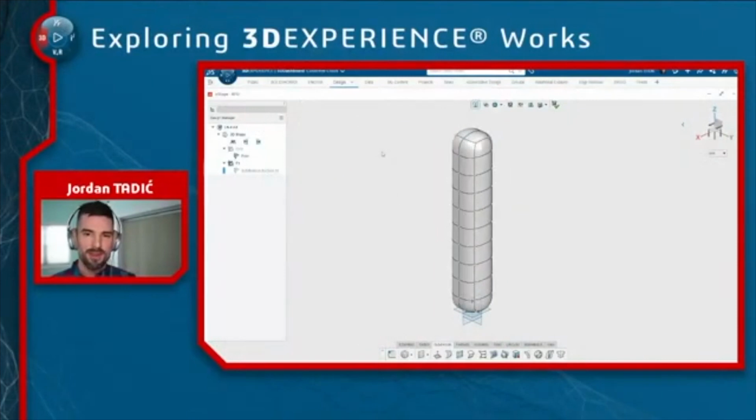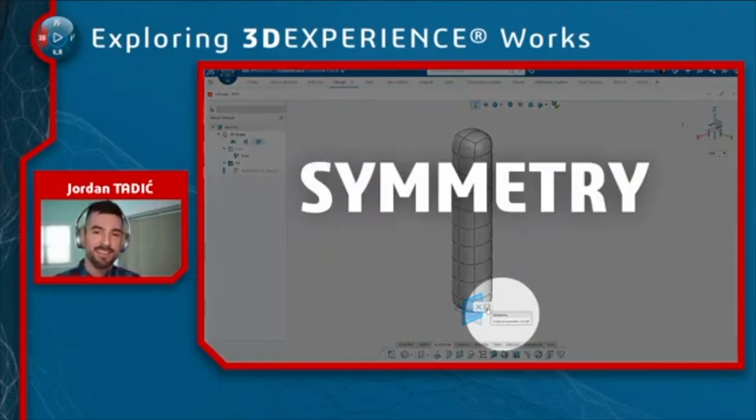Again, you don't have to put that much thought into it, because you could always insert loops or delete loops on the fly. And Gian, you showed last time adding symmetry to your design. Right. And already, in just the month that has passed between those sessions, we've added enhancements. Now I'm going to show you a couple of them today.